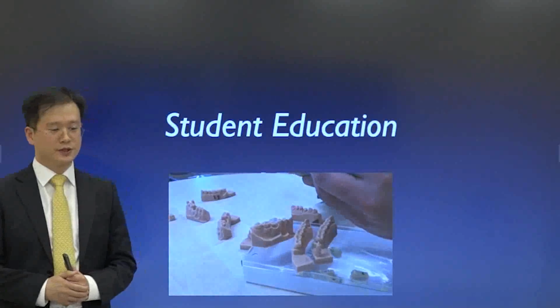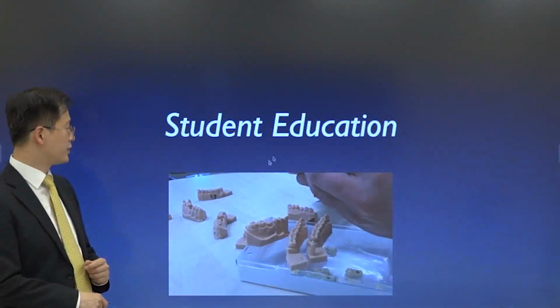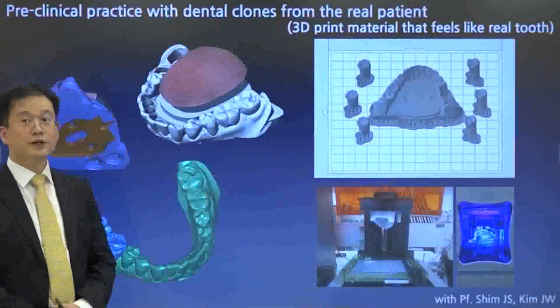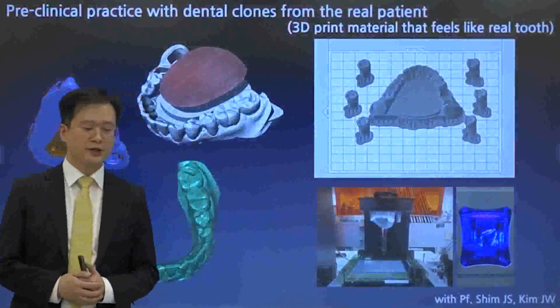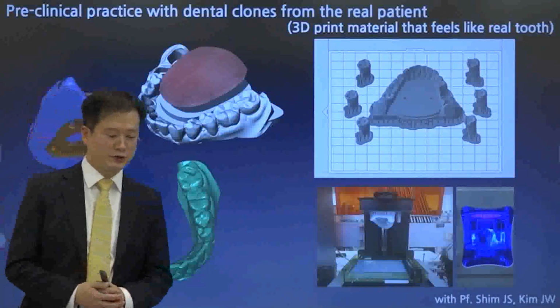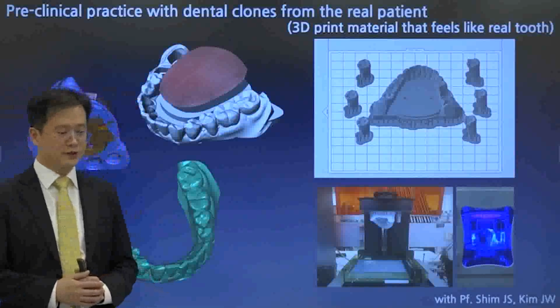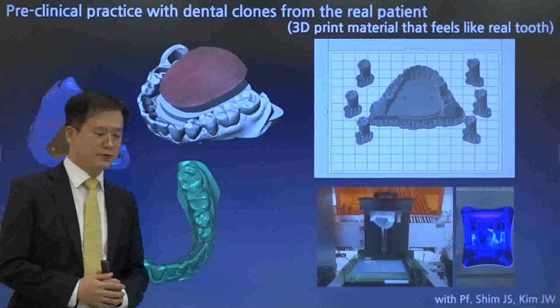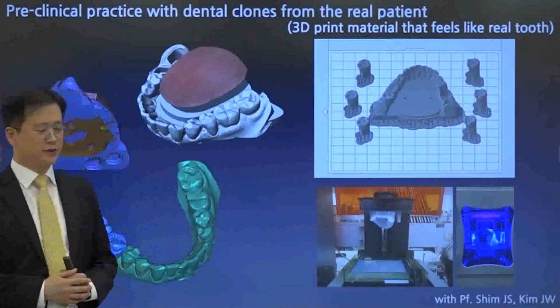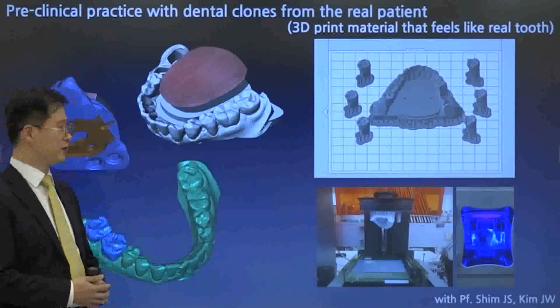3D printing technology can enhance the effect of dental education. We can print out the real patient's model in 3D printed material. Dental students are very nervous when they first prepare a tooth for a crown. If I provide them with the 3D printed model of the patient who will actually be treated, in a material with the same feel as cutting an actual tooth, the students can practice on the same dental chair that they will treat on before the patient's visit. It is a very effective training.